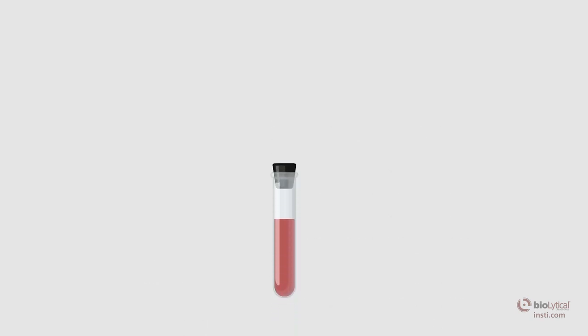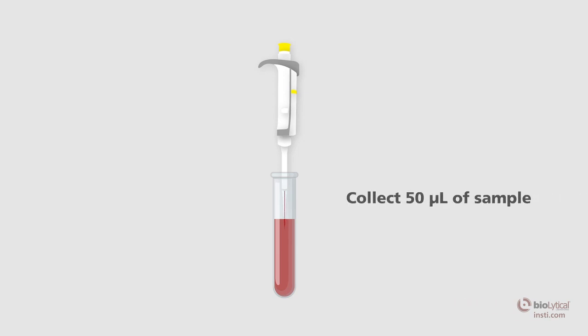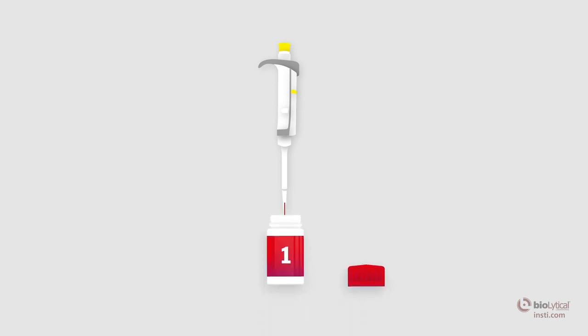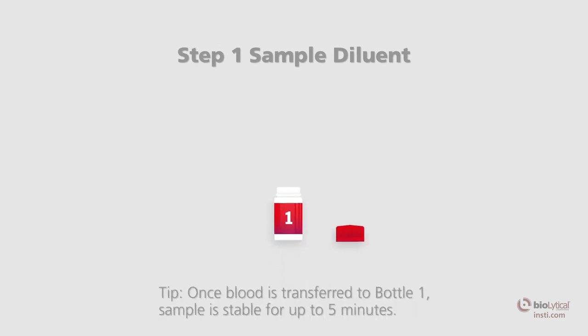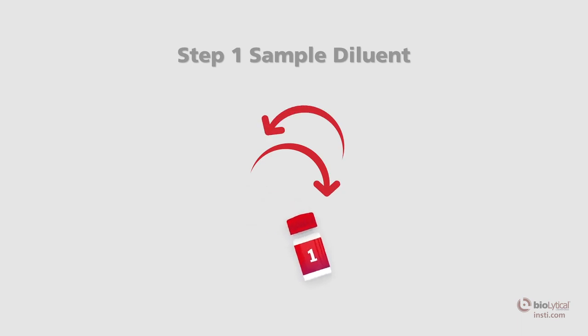Using a calibrated 50 microliter precision pipette with a disposable tip, collect 50 microliters of whole blood from the collection tube. Transfer the blood held in the pipette to bottle number one, the sample diluent. Once the sample has been transferred, recap the bottle and mix well by inversion.